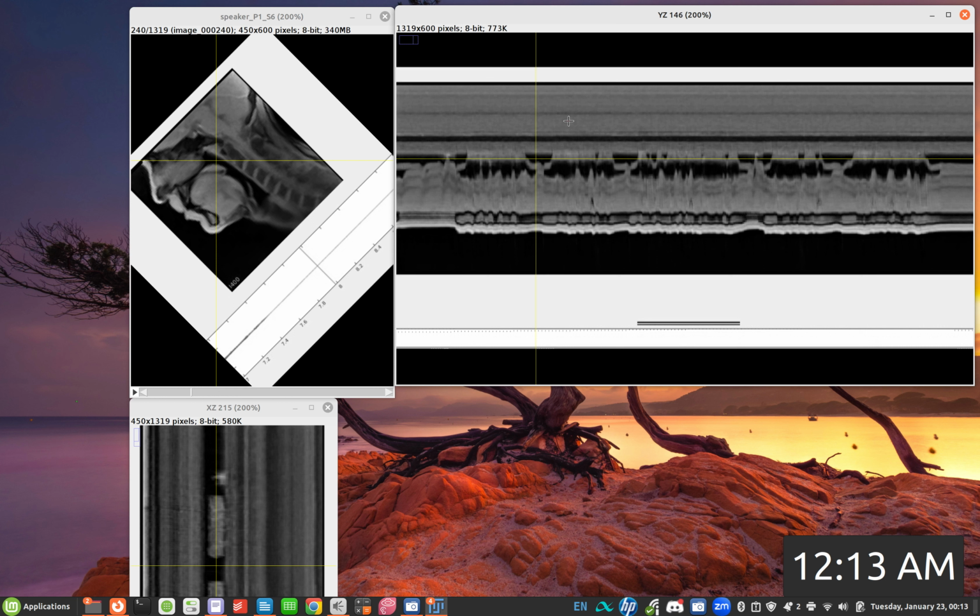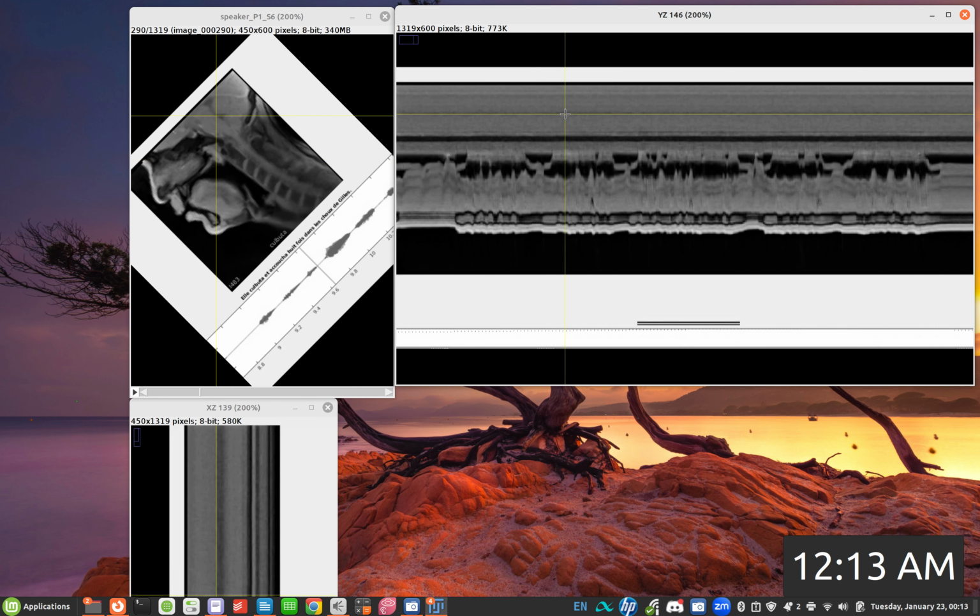Now, if we click around here, we shouldn't see any opening. Let's do that. And here we go. We see that actually there is no opening, so all white pixels. Now, what are these black pixels right at the bottom? That is showing the black pixels in the oral cavity, not the nasal cavity. So this is opening, this is closing in the velopharyngeal port, and that is all we need from this kymograph.